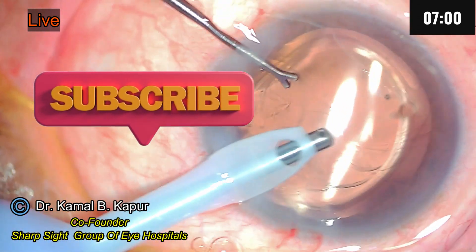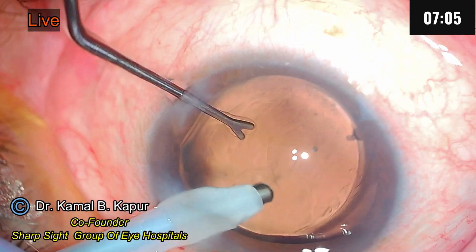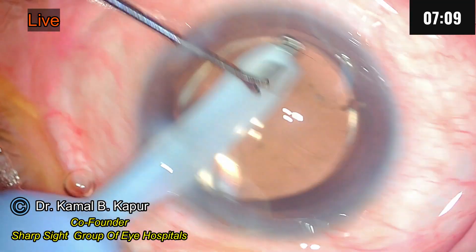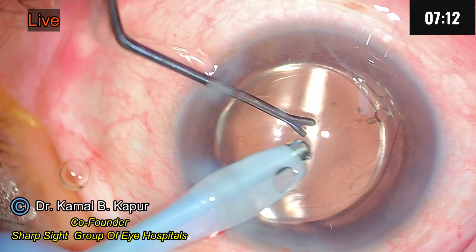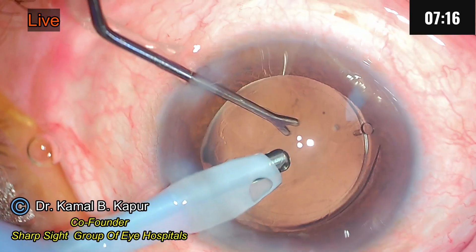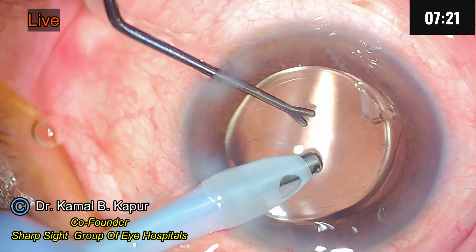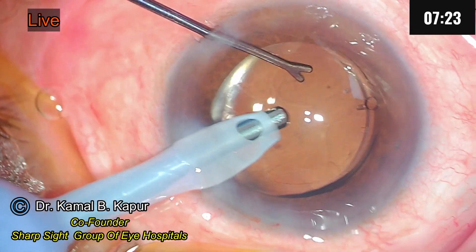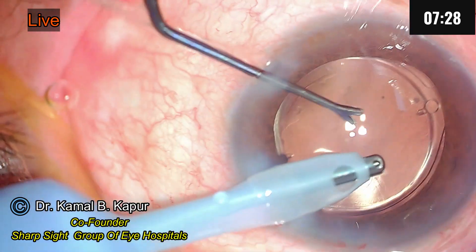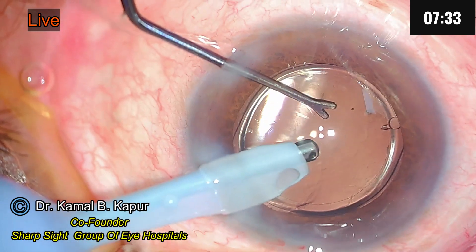The advantage of this IntelliAxis is huge. Number one: it takes care of the parallax of the movement of the eye. Number two: the accuracy of the alignment is always maintained. Number three: postoperatively it is very easy to evaluate whether your lens is rotated or not — which most other systems probably will not benefit from — because these marks on the capsular axis are permanent. At any time during the postoperative period, you can just dilate the patient, examine them on slit lamp, and find out whether the alignment has moved from the intended axis or not.